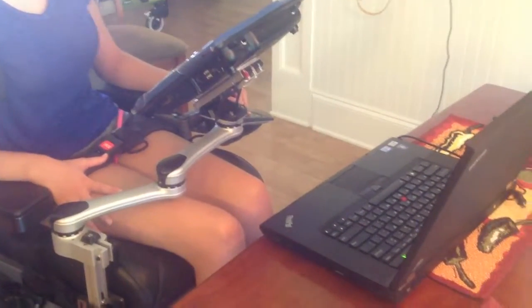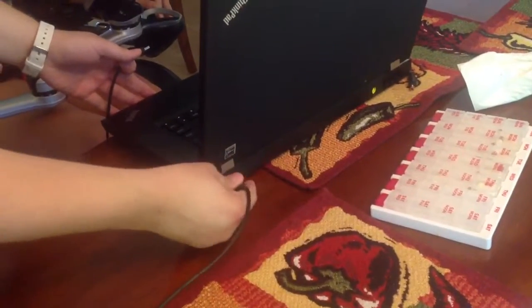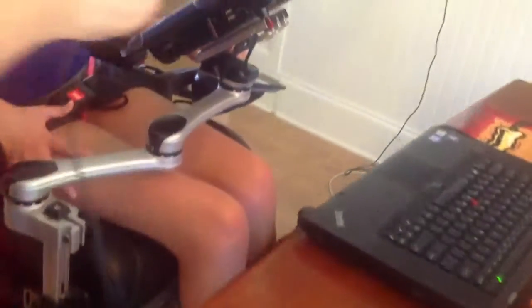This video is going to show you how to hook up Kayla's Echo device to her laptop. There's a cord that goes from the back of the computer — there's a USB port back here. It will go in any USB port, but this one at least matches the same side of the computer that the plug is on her device.